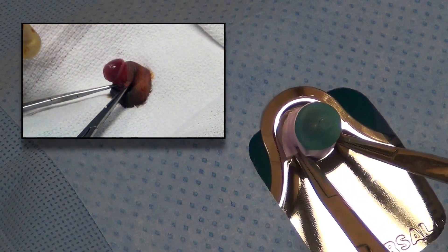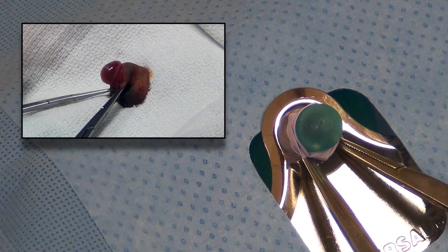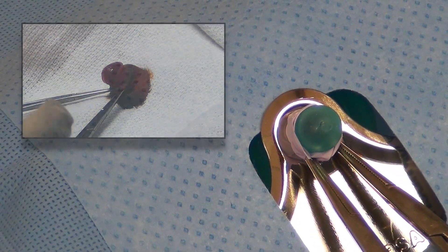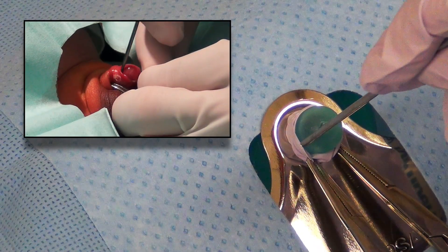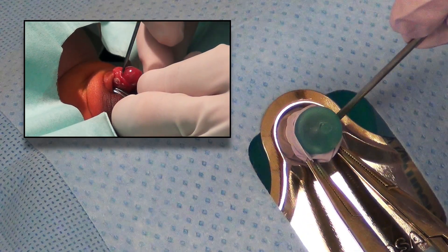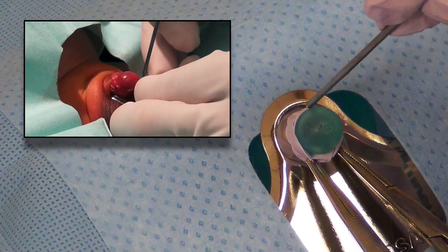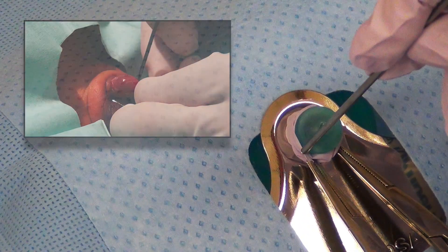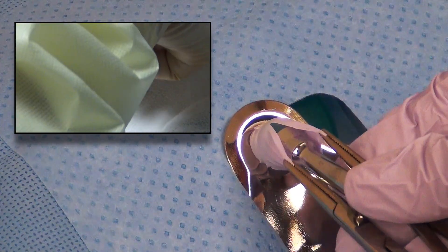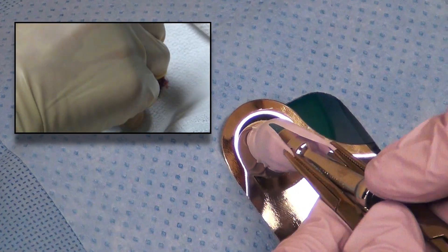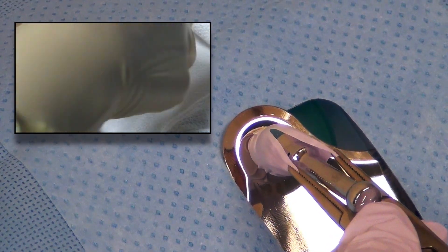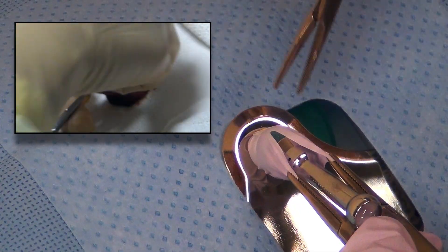The foreskin can then be easily retracted and any remaining adhesions can be taken down with a blunt probe. The bell of the Gomco clamp is then placed over the glands and the foreskin is held in position over the bell with the hemostat.